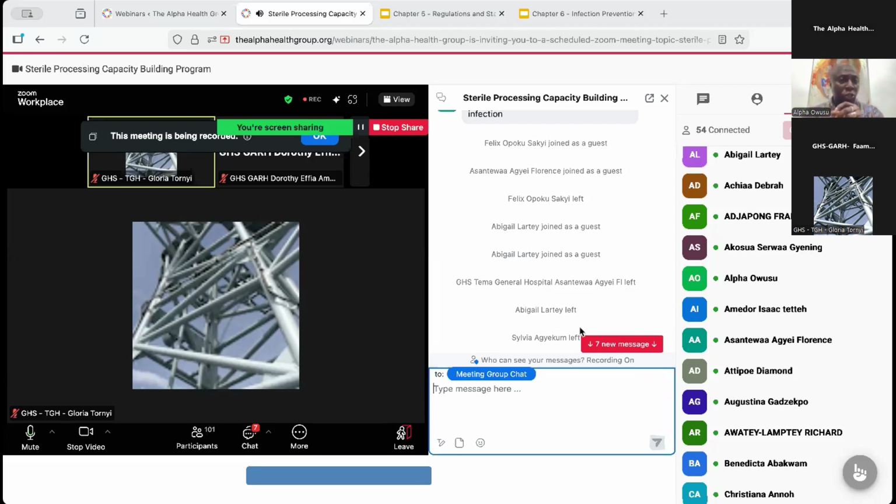There and then you suppress the infection, the bacteria, to where they cannot grow, and then you bring it to the decontamination area, where airborne pathogens cannot live. You clean them, you disinfect them, you put them through thermal disinfection. These are processes. You are killing whatever got contaminated from the patient, making sure everything is done properly, and it goes to the prep and pack area, where you clean it and inspect it. Don't forget, food for thought: when it is not clean, it's not sterile.